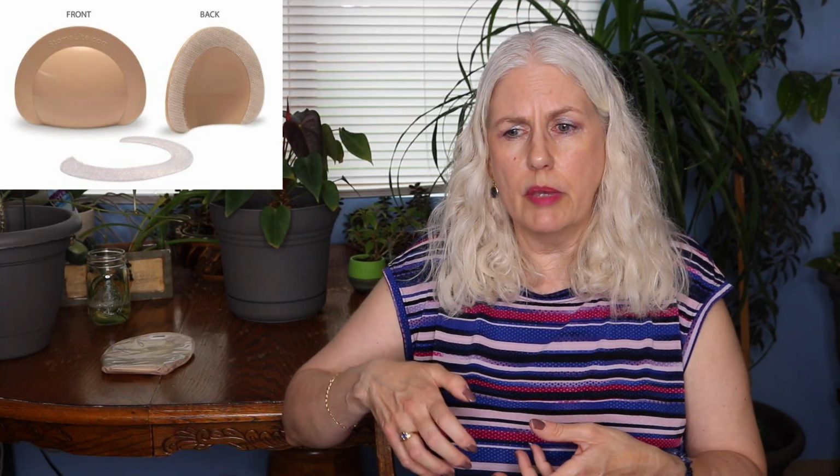Say you're going to get a massage or some medical procedure, and you need to lay on your stomach. You can take a towel and really roll that up and put it around the whole stoma area so that it gives some height to it, so you're not laying completely on your stoma. There is also a stoma dome that you can put on there as a covering, that can help make room for where the output can go out.